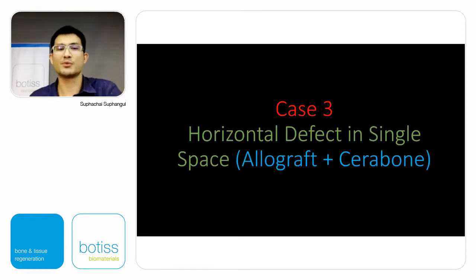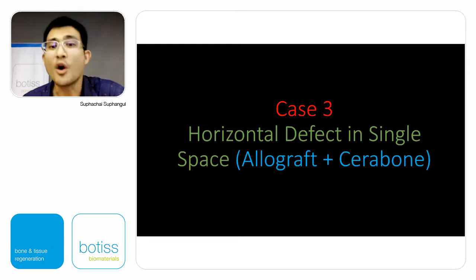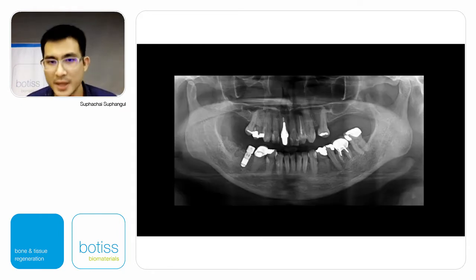Okay, time is almost running out. I have 10 minutes more. This one is the last case. It's a horizontal defect in a single space. Because the horizontal defect is not much and is very small, I use just an allograft and xenograft mixed together.